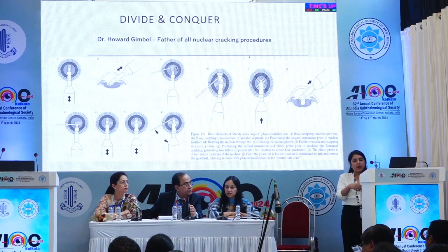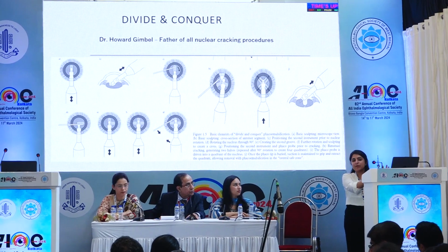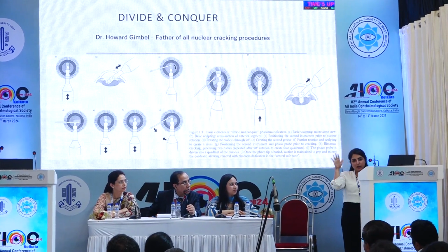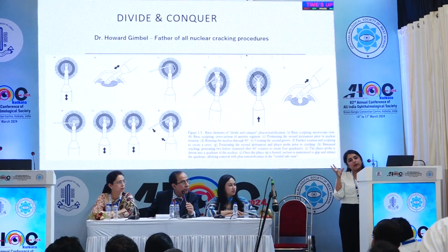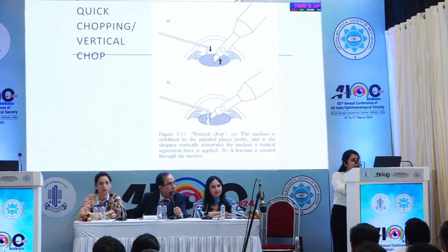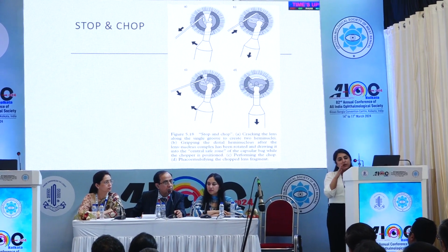So, like I mentioned before, roughly the power setting is maximum when we are trenching and the vacuum is low. Vacuum will be covered by ma'am. When we are trenching, the rough formula I've given is grade of nucleus into 15 plus 25. Once you've trenched, you crack the nucleus and then you rotate it. And once you have the 2 heminuclei, you start chopping them.